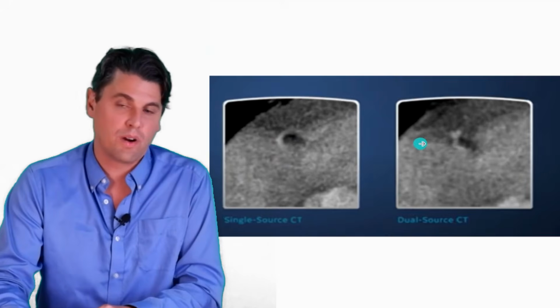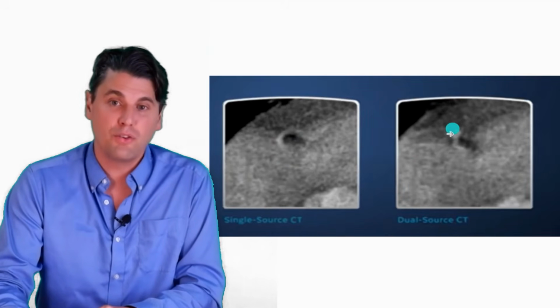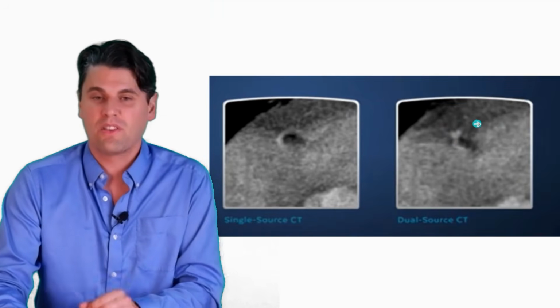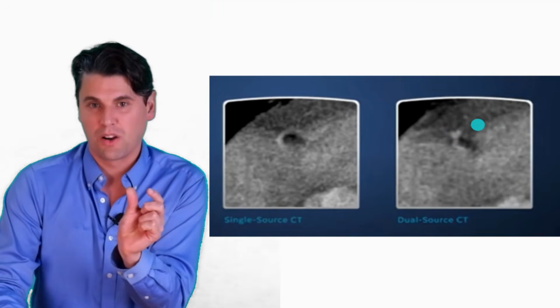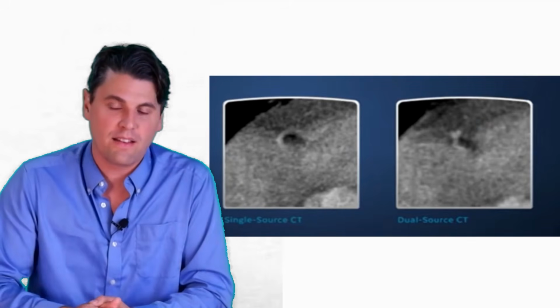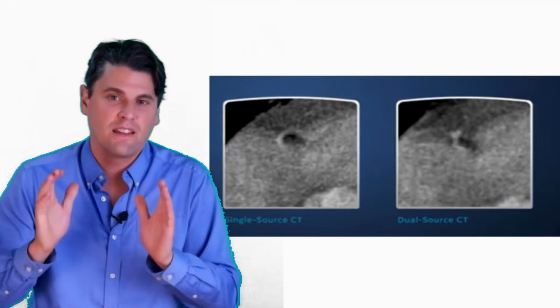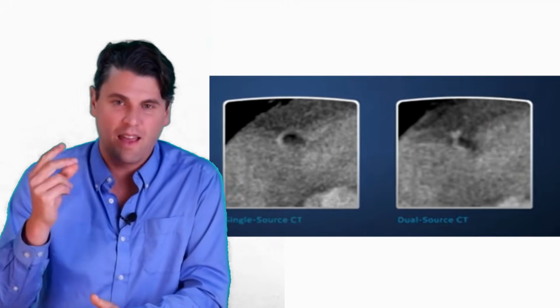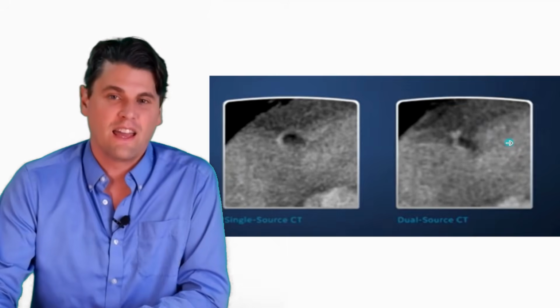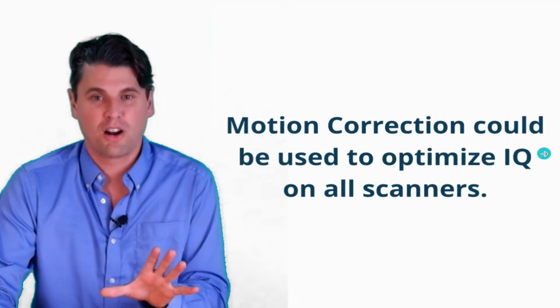And in the case of a dual source system, you're actually going to have 2 tails that are going to be added together with one another, but those tails are each significantly shorter. So there's actually less of a span of the artifacts, but you can see that there is not the ability to take a perfect image. Even with dual source scanning, there is potentially still motion artifacts.